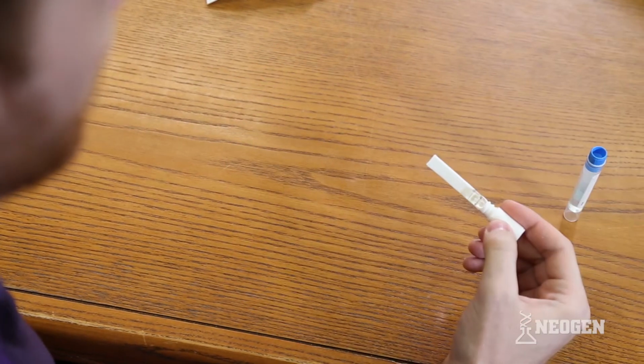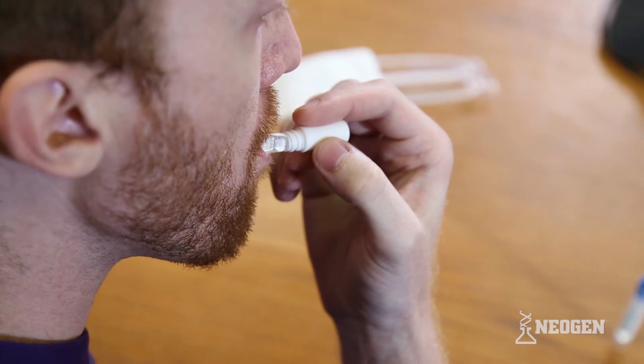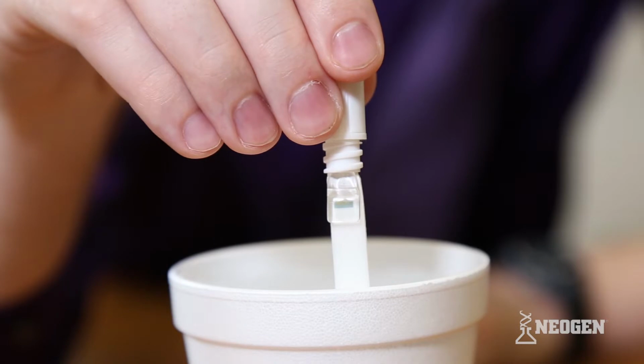This pooling process will help provide the most efficient results. 6. While holding the NeoSal handle, the donor should insert the collection pad between the cheek and gum line at a slight downward angle, with the SVAI facing outward or away from the donor's mouth. Instruct the donor to leave the clear plastic window with the SVAI outside of the mouth and visible during the collection process. Instruct the donor not to talk or bite the device during sample collection. 7. The donor should keep the NeoSal in their mouth until the SVAI forms a distinct blue line across the clear plastic window. Typical collection time is 1 to 2 minutes.